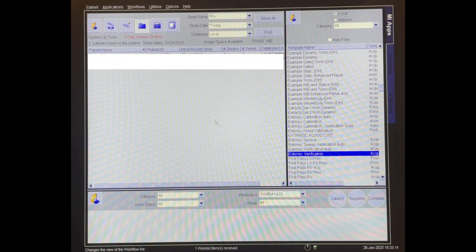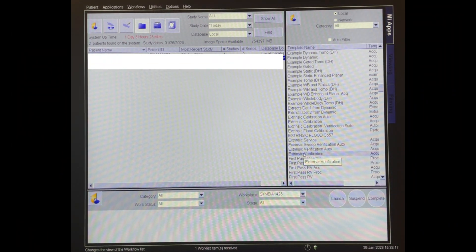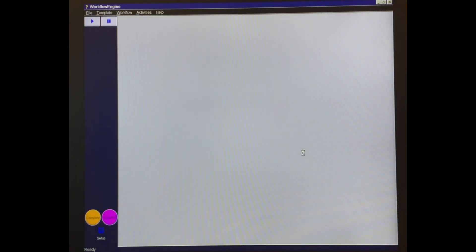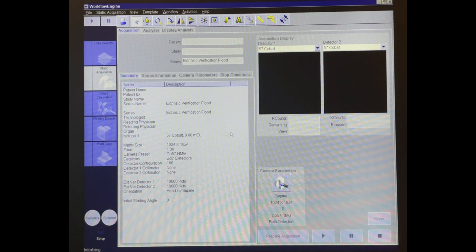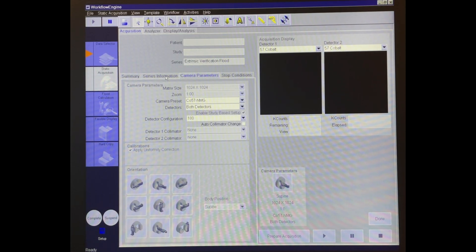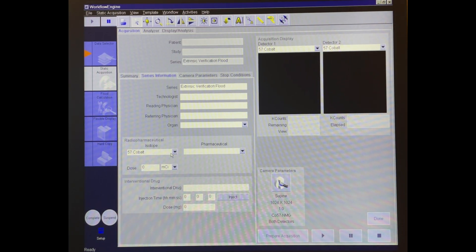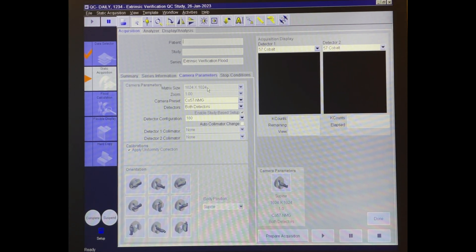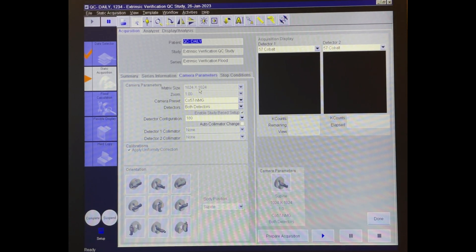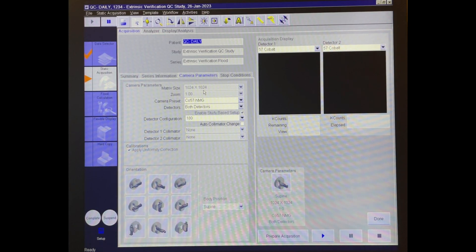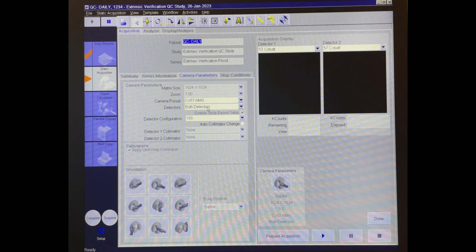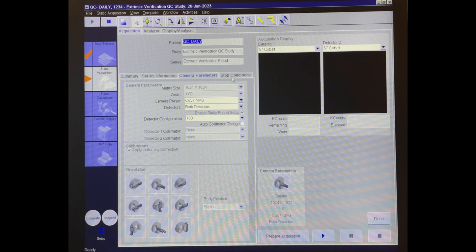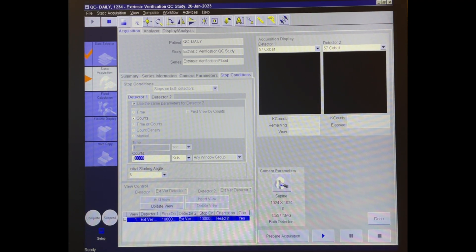Now that we have our sheet source positioned, we can go ahead and set up our flood image and select our protocol. We want to make sure that the isotope is set to cobalt, because this is an extrinsic flood. We've got a 1024 matrix on a Siemens system. We have to run in a 1024 matrix to get our quantitative values at the end, and we are running on both detectors. We want our stop conditions to be at 10 million counts, or 10,000K counts.